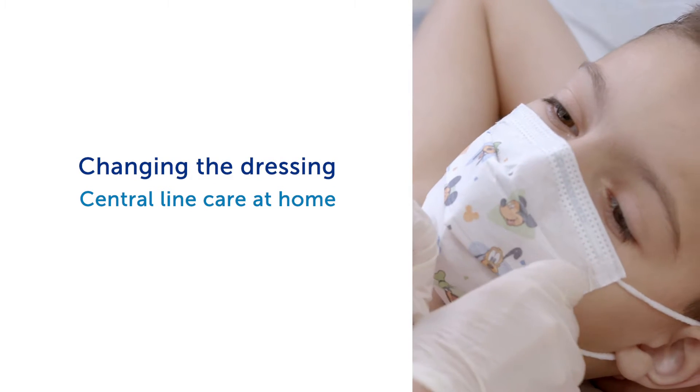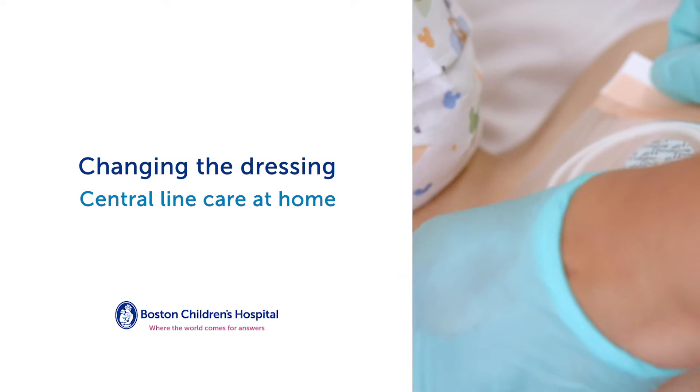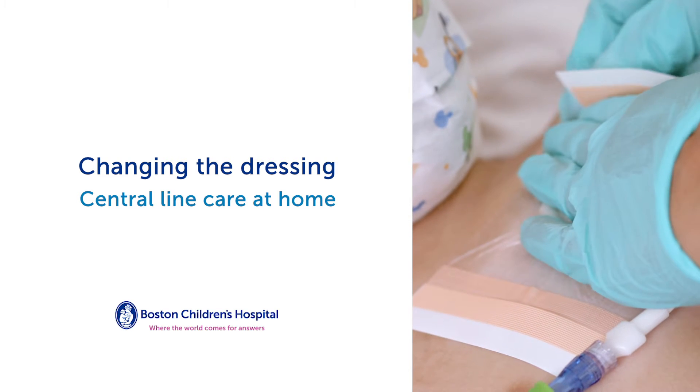Changing the dressing. In this video, we're going to talk about how to change the dressing on your child's central venous catheter. You will need to change the central line dressing every seven days, or if it gets loose, dirty, or wet. Follow these steps.